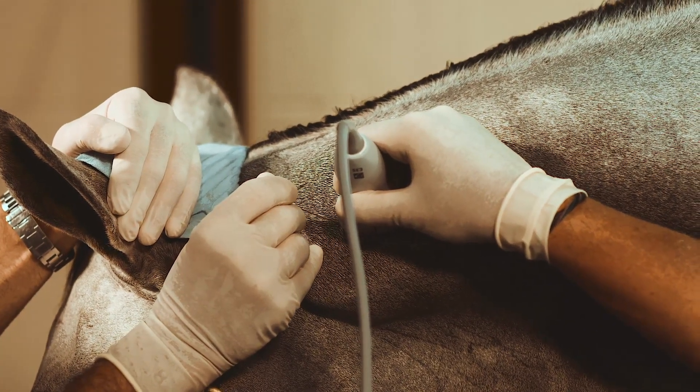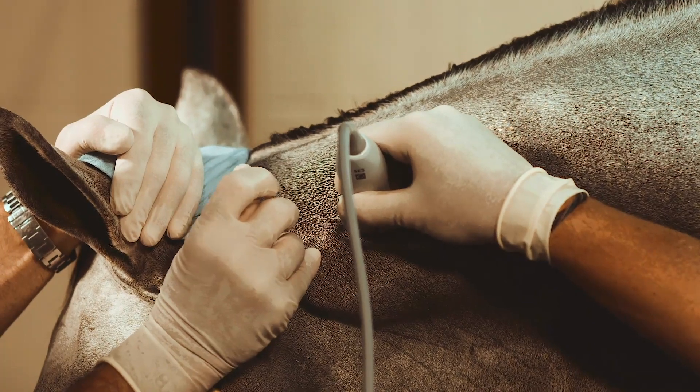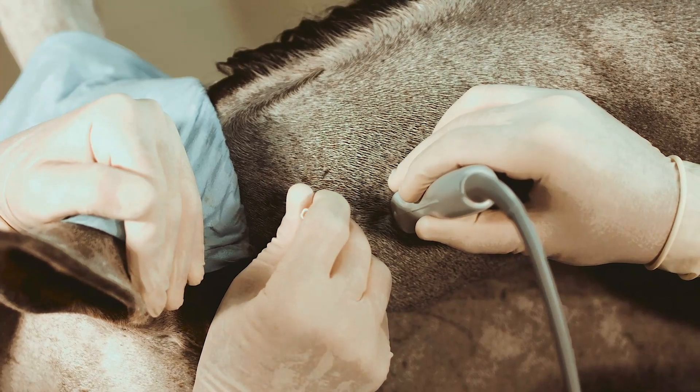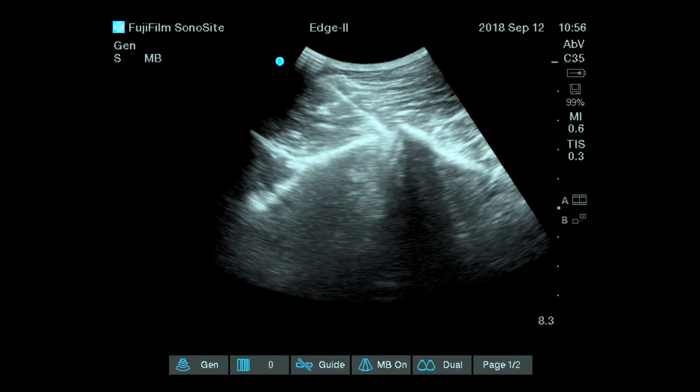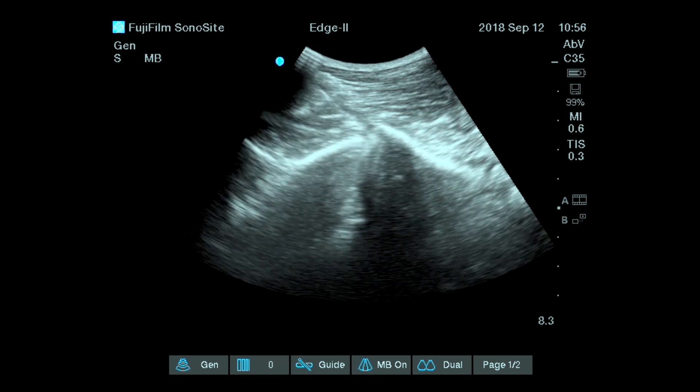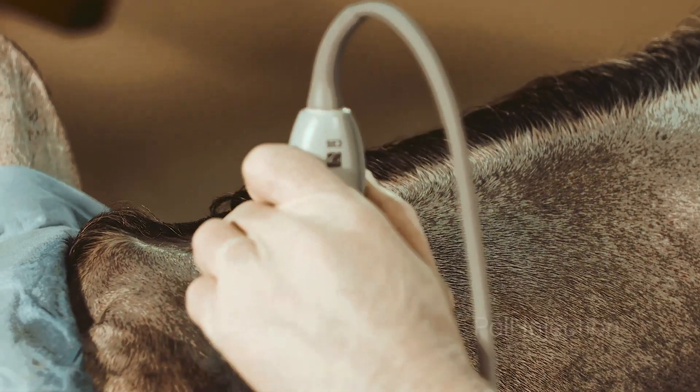Okay, perfect. A little bit deeper and we are just going to catch that. Okay, and push. Perfect. So this is the injection of C1-C2.